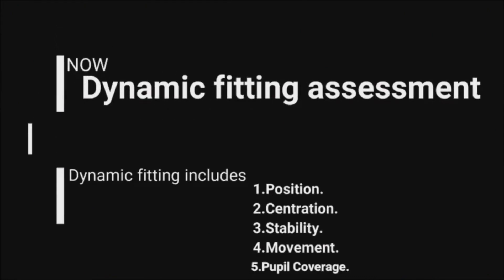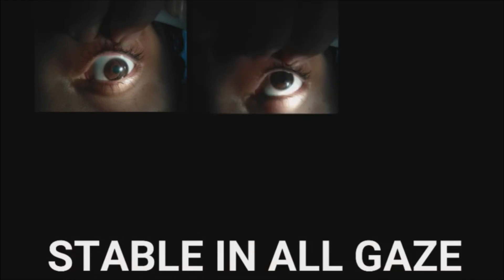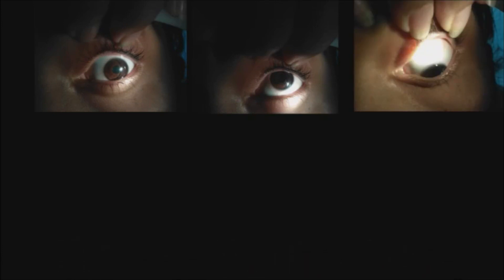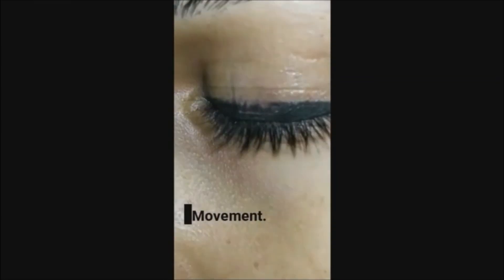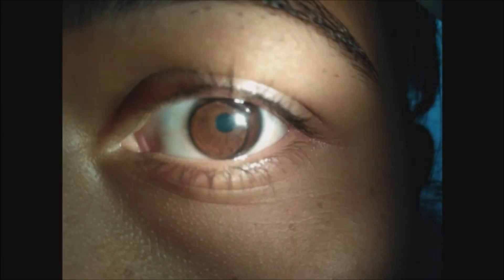Now let's move on to the dynamic fitting assessment. Dynamic fitting includes position, which is 0-0, and centration of the lens, which is centered. Movement of the lens is checked after a blink. Stability of the lens is stable in all gazes. Lastly, in dynamic fit we check the pupil coverage, which is full in our case.